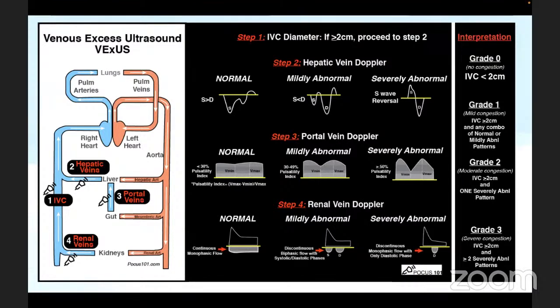Sir, most of the time we should be able to visualize the IVC unless the incision is in the midline where you are not able to visualize the IVC. Maybe then in the coronal planes, we should be able to appreciate the IVC, sir, because it is a cylindrical structure. If you are not able to see in the sagittal plane, we should be able to see in the coronal plane. Unless the patient is very bad and there is abdominal distension and severe sepsis, if you are not able to visualize, yes, that is one of the pitfalls.